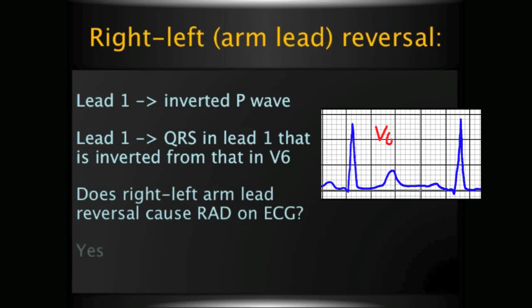Yes, it does. Right-left arm lead reversal causes RAD.